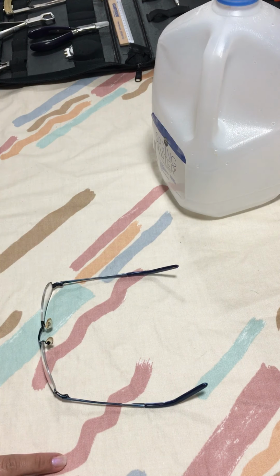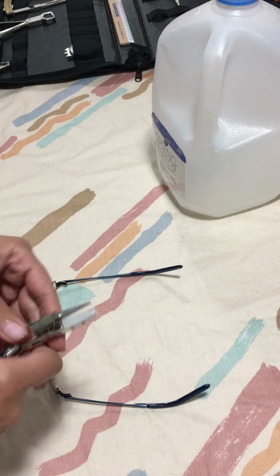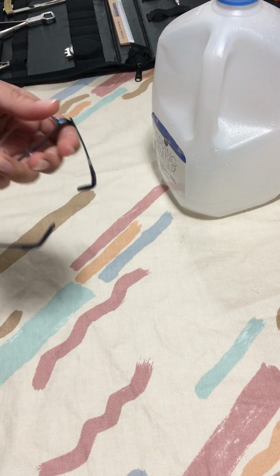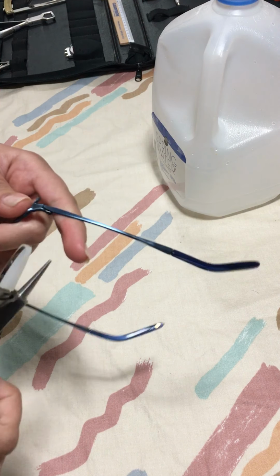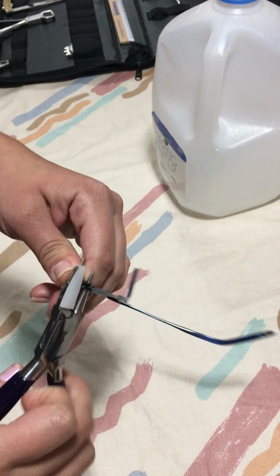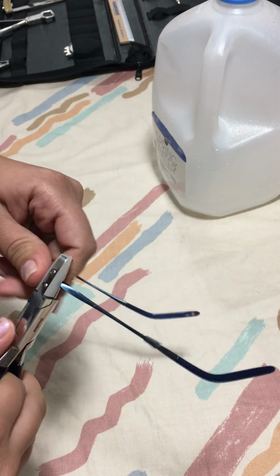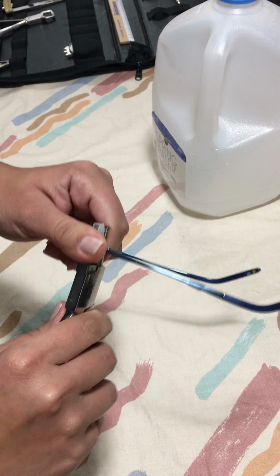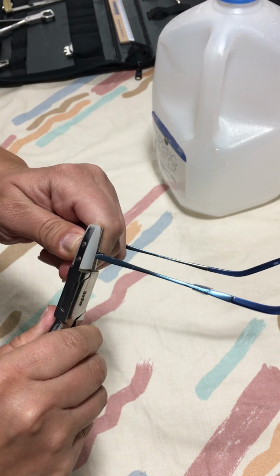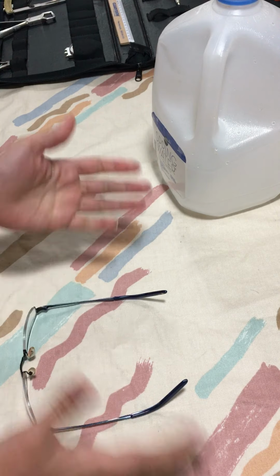We are gonna be using the nylon half padded plier, this one right here. I'm gonna be putting the metal portion on the inside and the nylon part on the outside so it doesn't scratch the frame. Okay, so I'm gonna be putting pressure with my fingers. So I'm gonna be using my fingers as a tool and the actual plier as a tool. And I am gonna be turning away from me like so. That way I could close the temple. So I am gonna be moving a little bit. I'm gonna be checking my work.